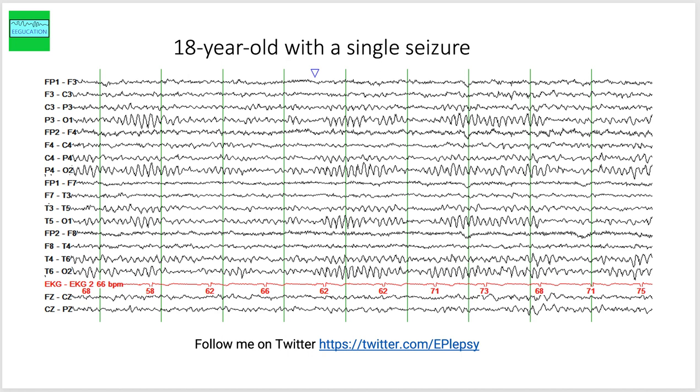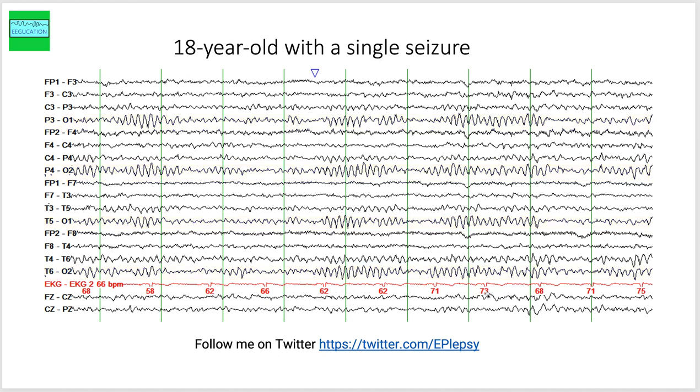Now this is an 18-year-old who was referred to the epilepsy clinic with a single seizure. You can see a very nice posterior dominant alpha rhythm here. The heart rate varies anywhere from 62 to 73 or 75 beats per minute.